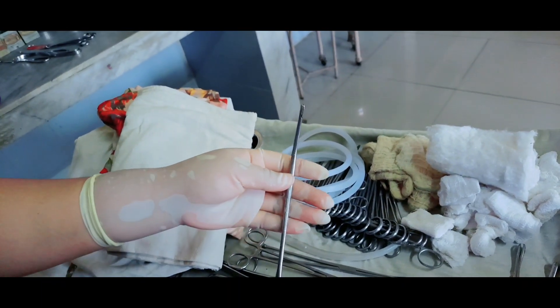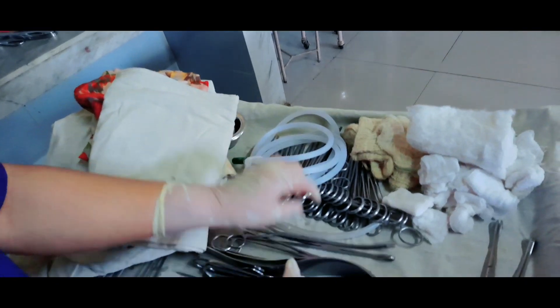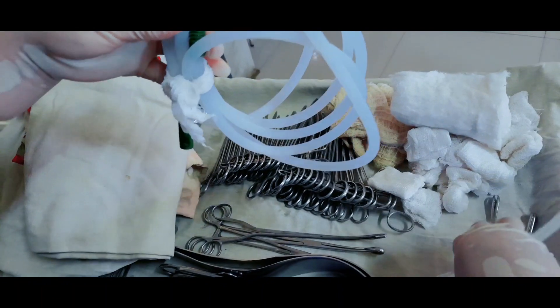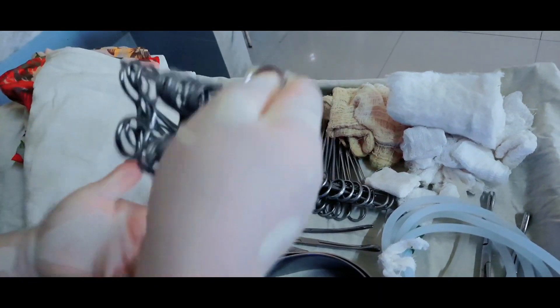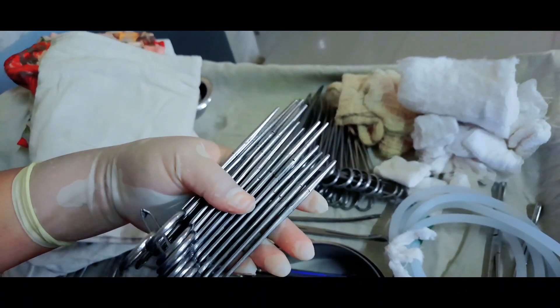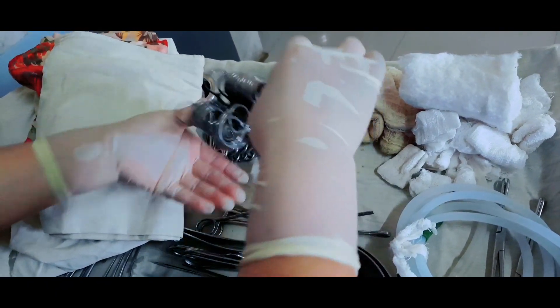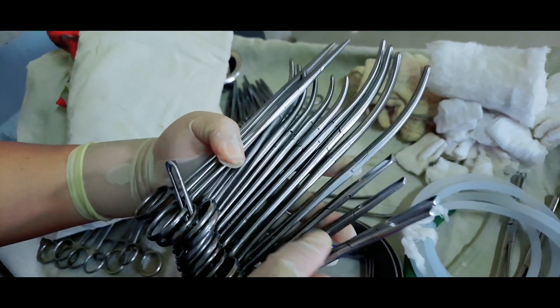Dissecting forceps, used if there is perforation in the gallbladder to remove the gallstones. Vacu-suck, also known as suction, for suctioning the blood. A bunch of straight artery forceps — 12 in number. Another bunch of Allis tissue forceps — 16 in number. Curved artery — 10 in number.